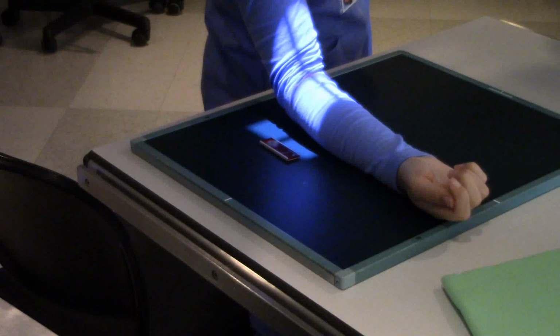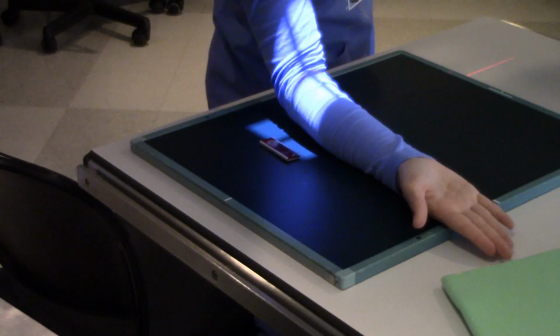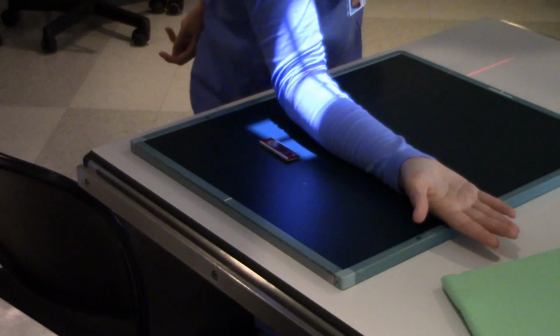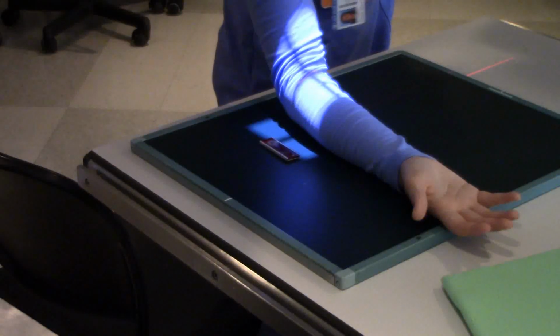Okay, so now we've got our central ray in the patient's elbow joint once again. So now we've got two images, one like this, one like this. Now, there's also a trauma external oblique, which I don't think is in the book, at least not in this book.